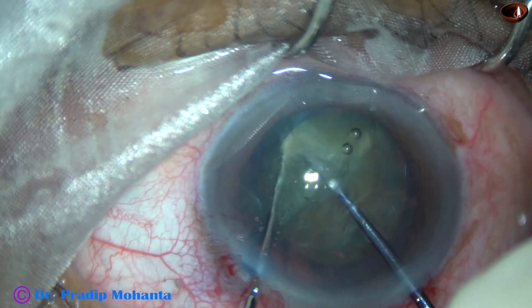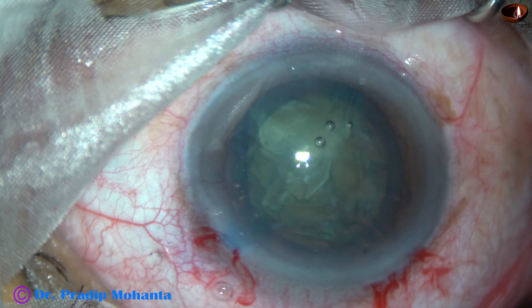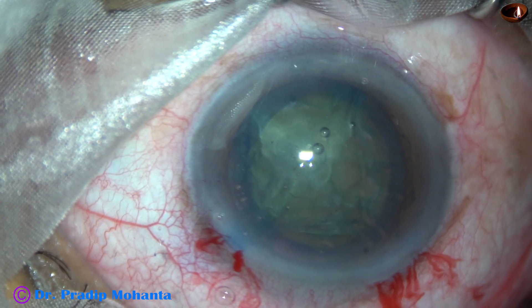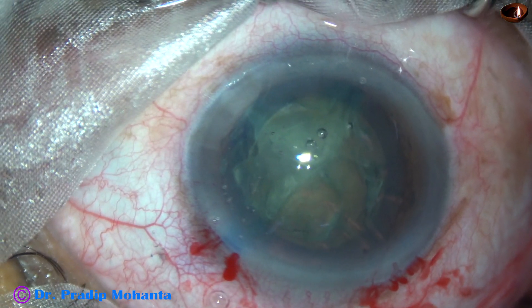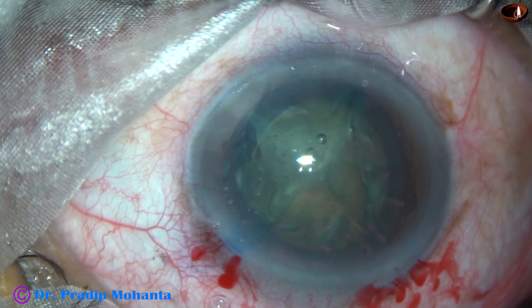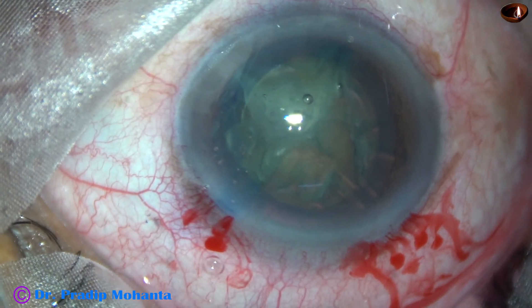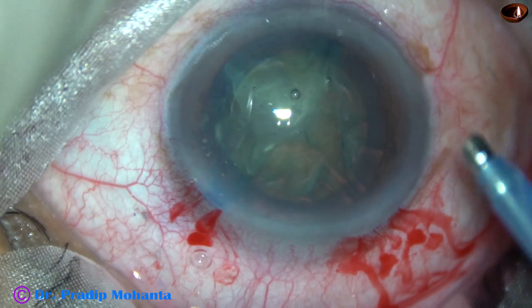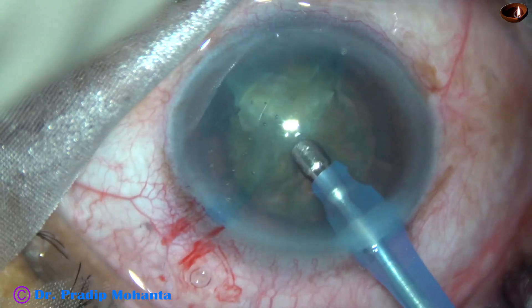We can divide the other hemi-nucleus also, but that is not necessary. If we want to divide the other hemi-nucleus, we have to inject visco again. Now the phaco probe goes in — I am using Oatley Cataract-3. This nucleus is on the softer side, so ultrasonic energy is not much; it is set at 60%, but most of the time I will be using 30–40% ultrasonic energy. Flow rate is 40 ml per minute and vacuum is 400 mmHg.